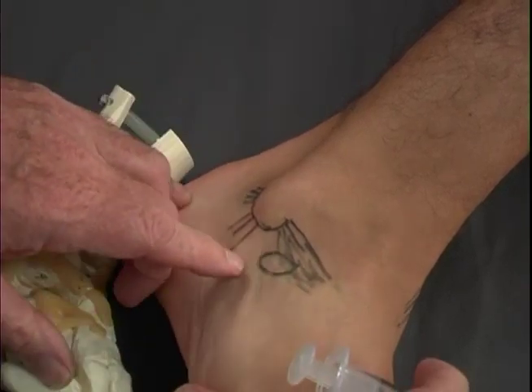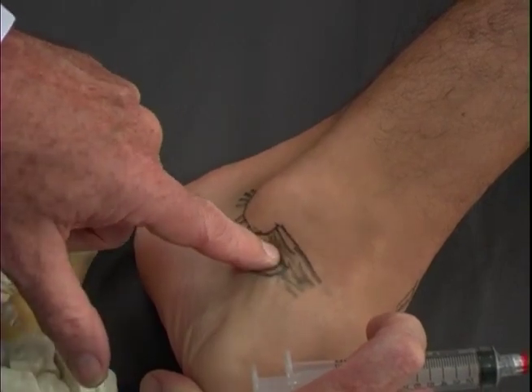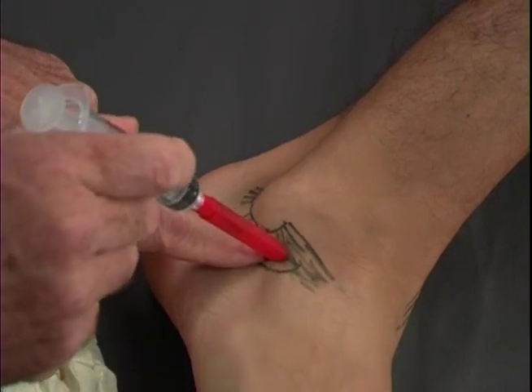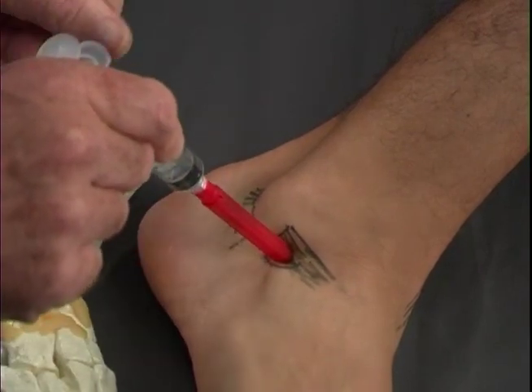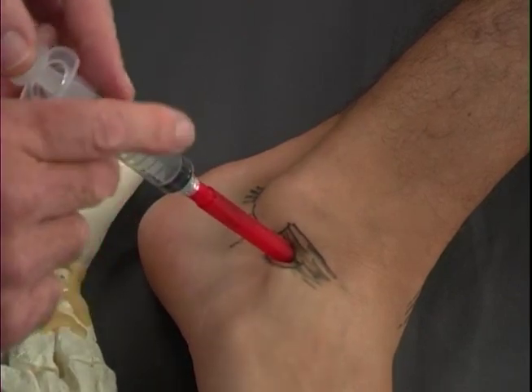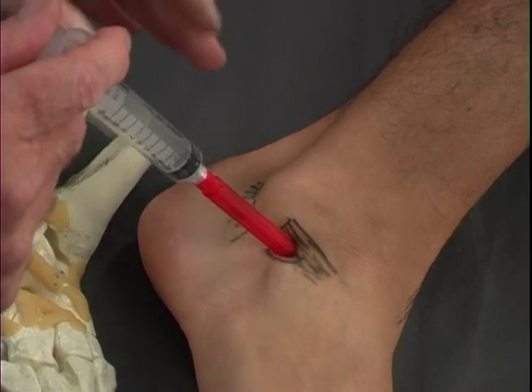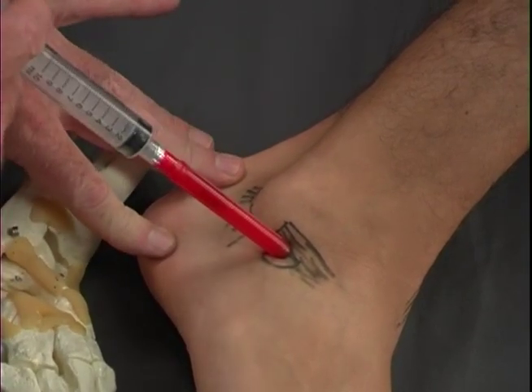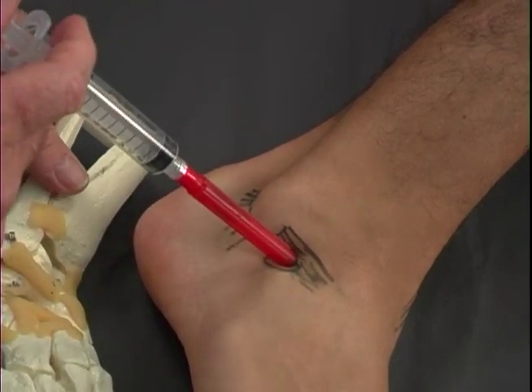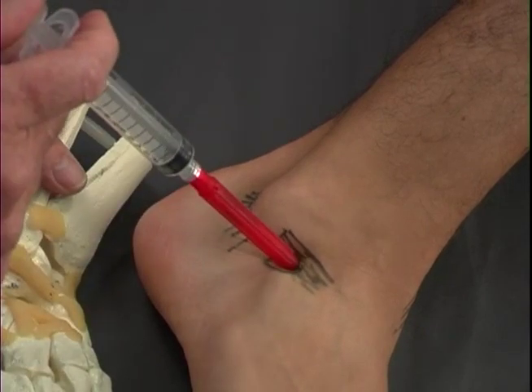And when we do the sinus tarsi, we can invert the foot a bit and put our finger right in the joint space, go directly into that. We can use a 1.5-inch needle or a 2-inch needle, and we can either deposit 3 to 5 cc's of our preferred solution into the area, or we can walk around and do the interosseous talocalcaneal ligament inside it on bone.